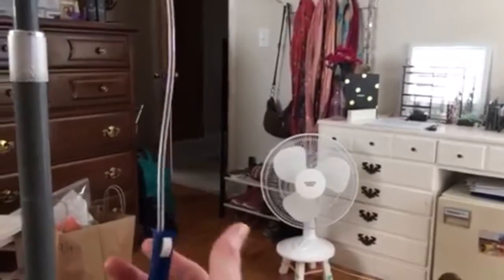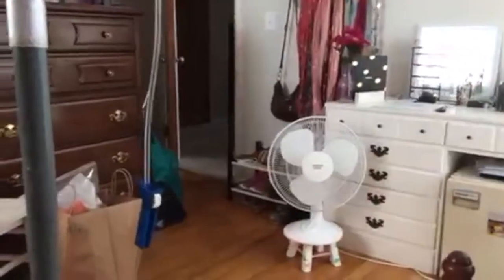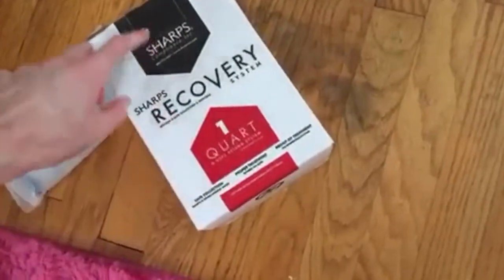Even with my other IV antibiotics I would have to count over a half hour — one one-thousand, two one-thousand — and so I'm hooked up right now. Another really exciting thing is that they actually gave me a sharps box! A sharps box — finally! It's so cool.